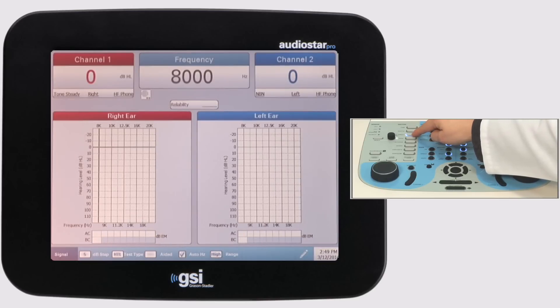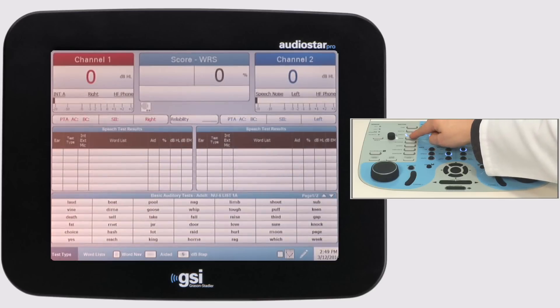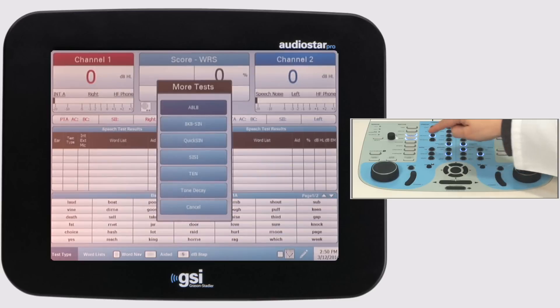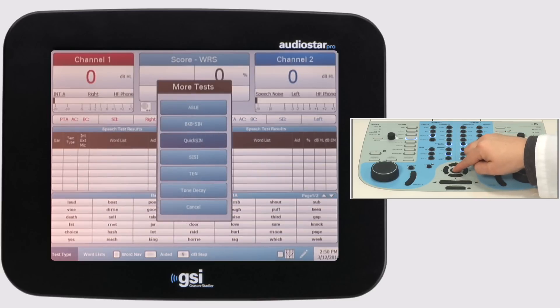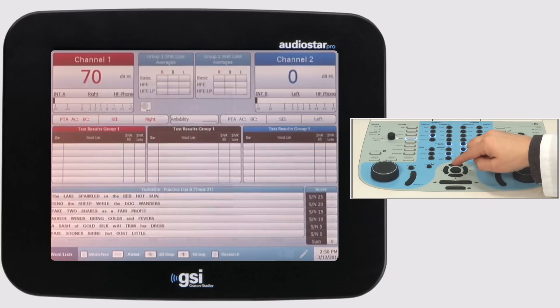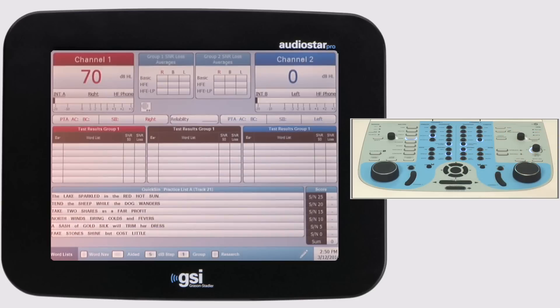Integration of word lists and special tests such as QuickSIN, BKB-SIN, and the TEN tests allow for advanced diagnostic evaluations without an external device.